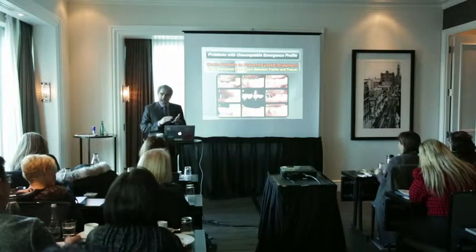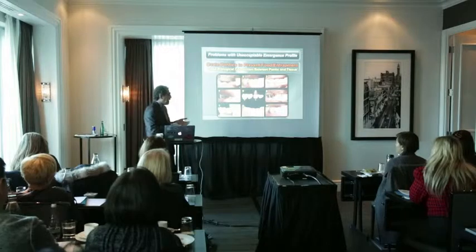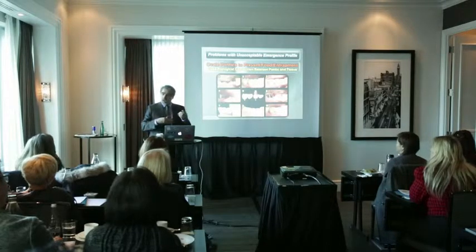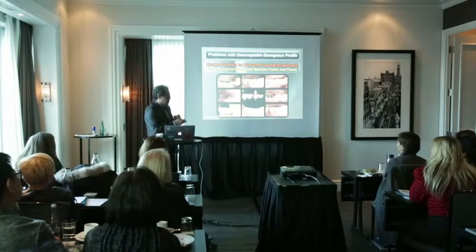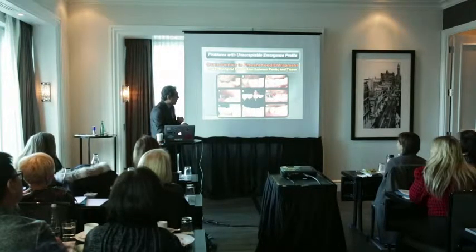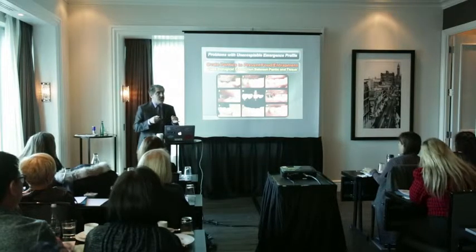Number two, if you have to make a pontic, if you have to have a crown like the other one that I showed you with a long cantilever side placed off center, it's always better to start, in this case, with a temporary. With a temporary, you start pushing against the tissue.